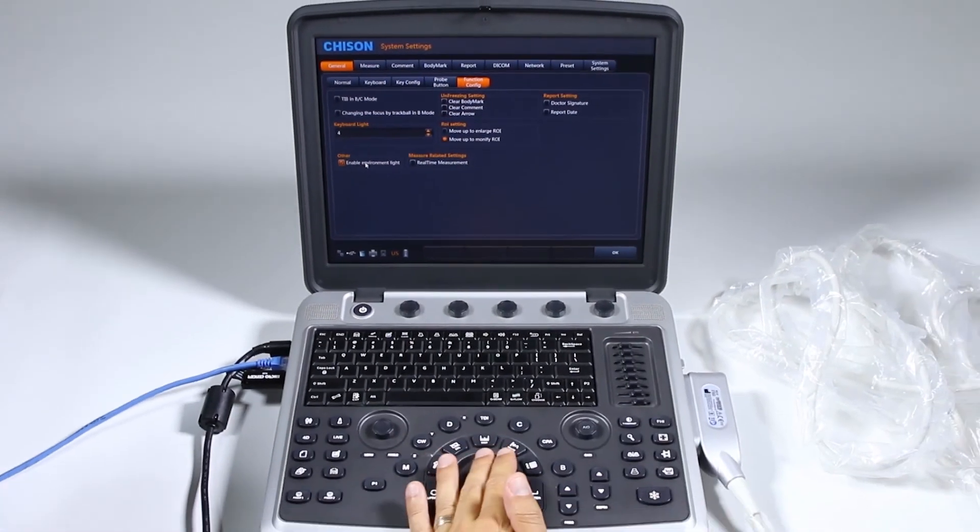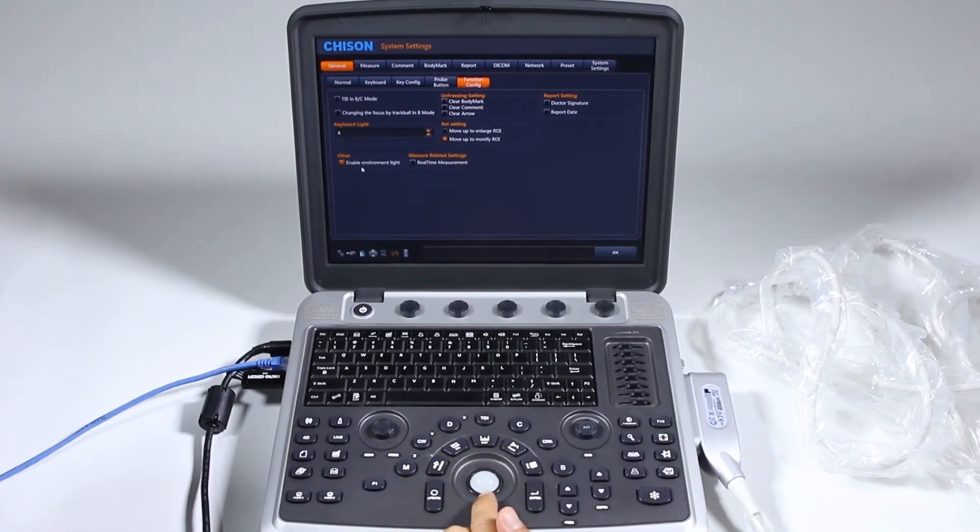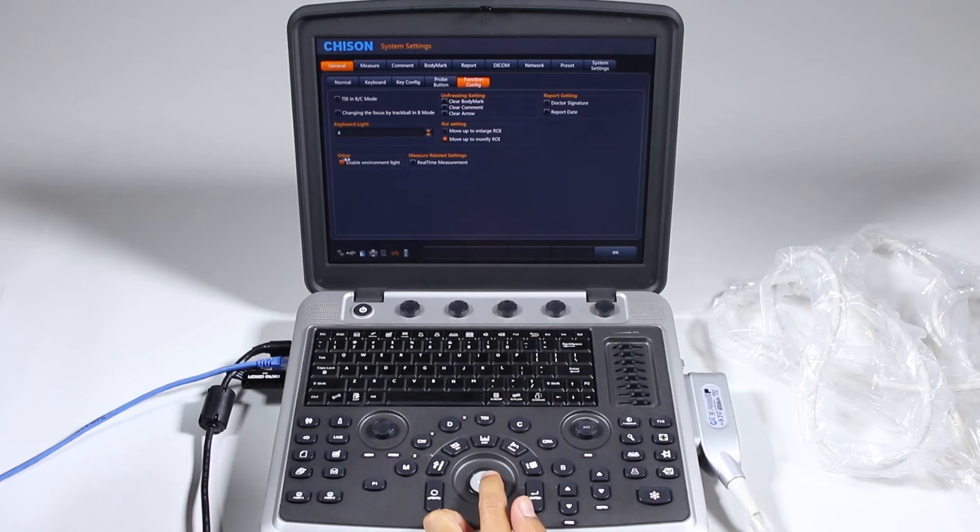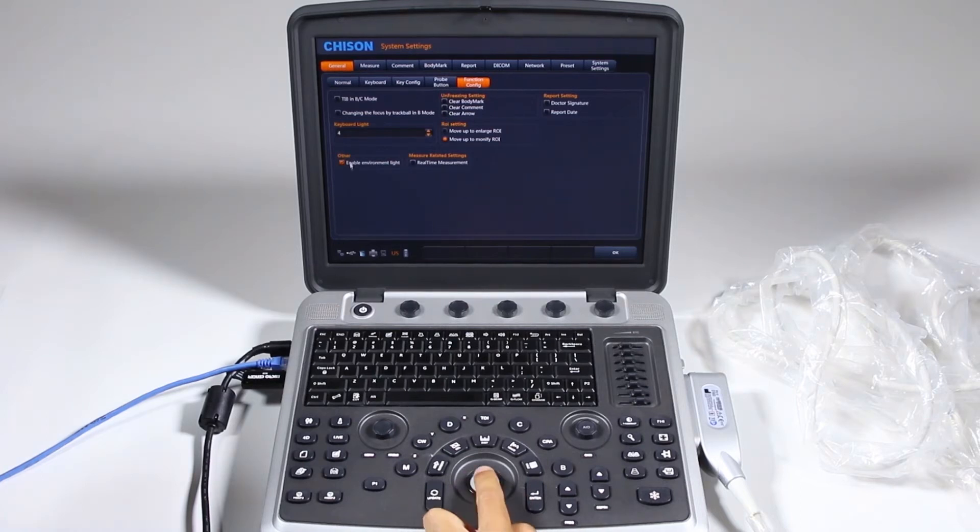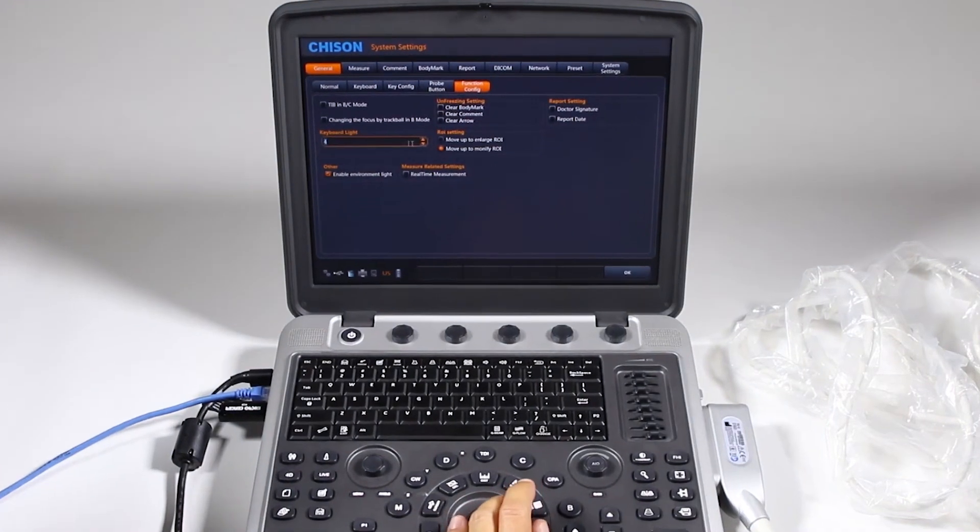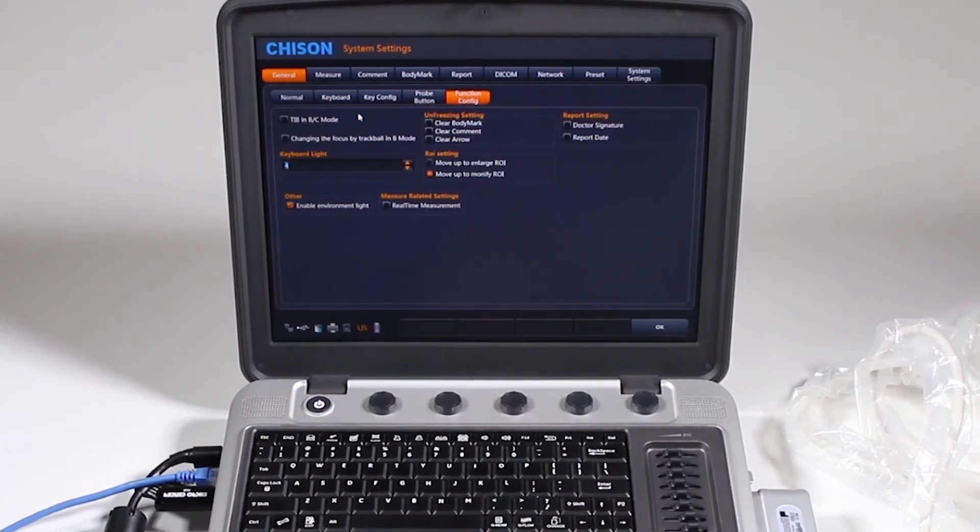One thing you'll notice also is this trackball lights up, that's not an environmental ambient light feature, that's the trackball will light up as soon as you touch it. The brightness of the keyboard light, various items there.